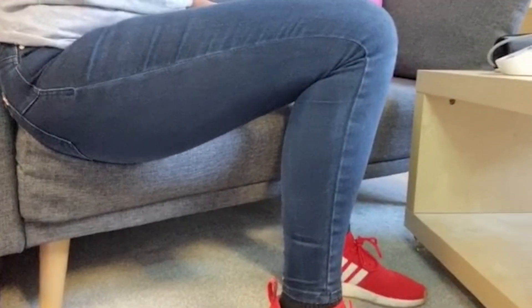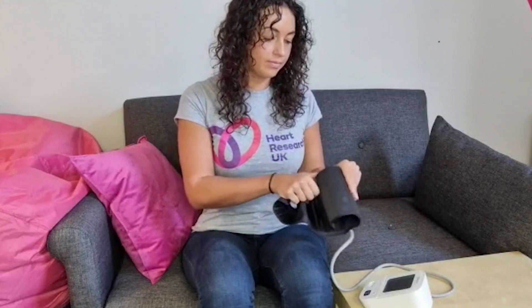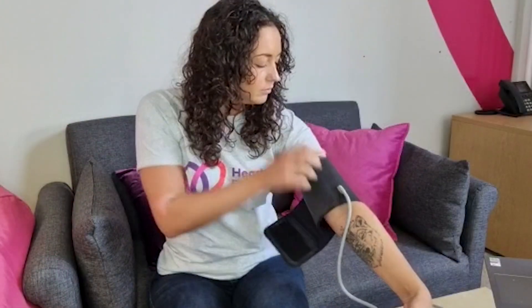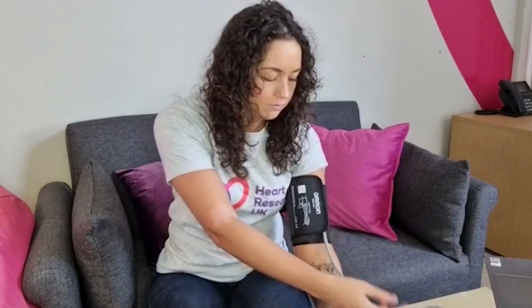Sit comfortably in a chair with your legs and feet uncrossed and your feet flat on the floor. Attach the cuff to the monitor. Roll up your sleeve or wear an accessible top. Put your arm through the sleeve with the wire facing down towards the machine.